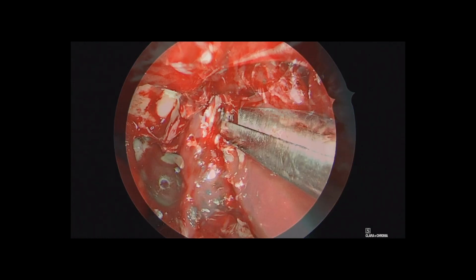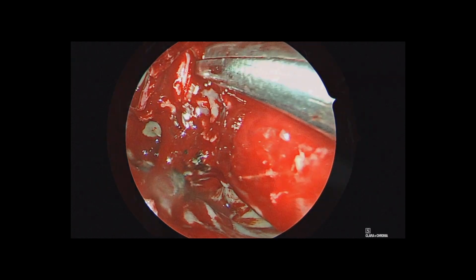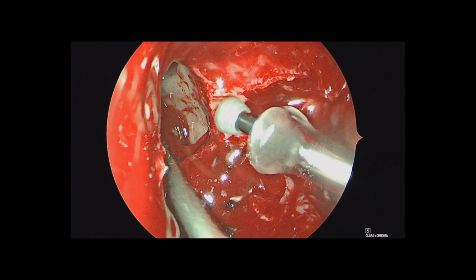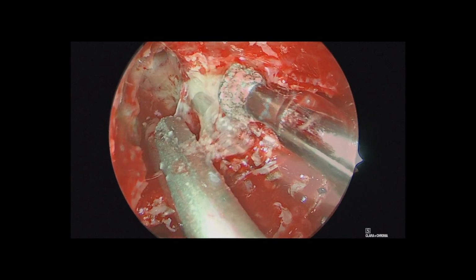Here that nerve has been mobilized into the nasal cavity, and here we are working just a bit posteriorly and high as we're opening up the rest of the pterygopalatine fossa towards foramen rotundum. Once we've identified that, we begin to drill over top of foramen rotundum to expose this area back towards Meckel's cave.